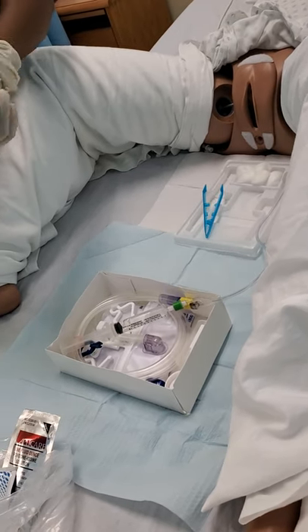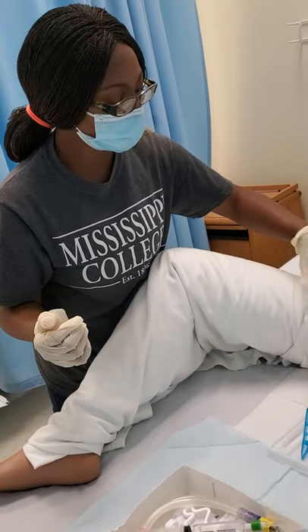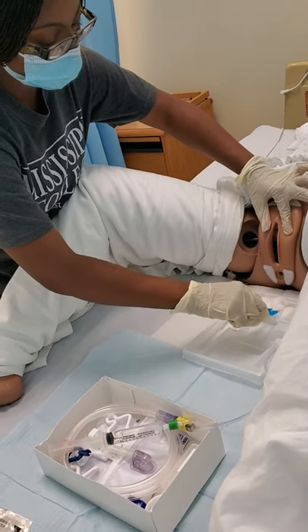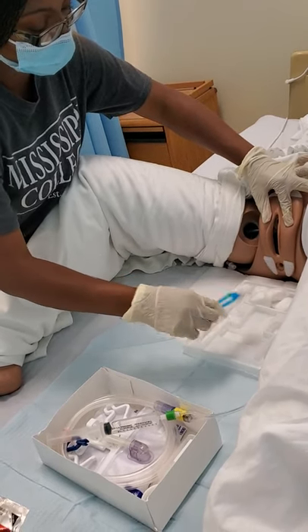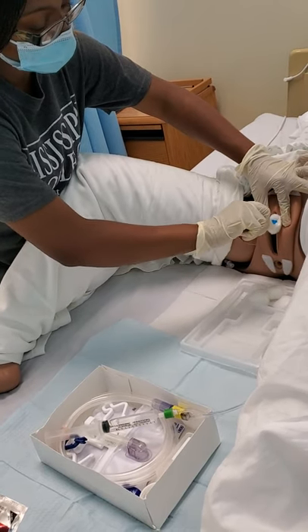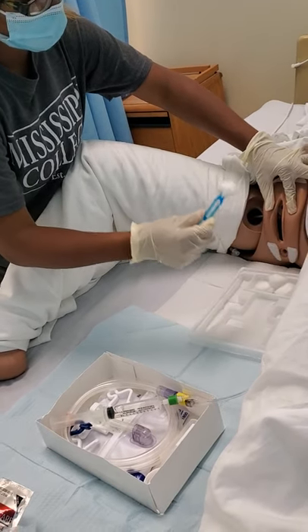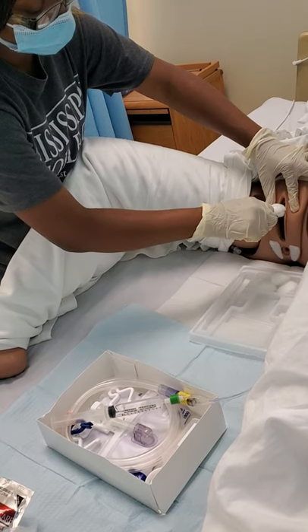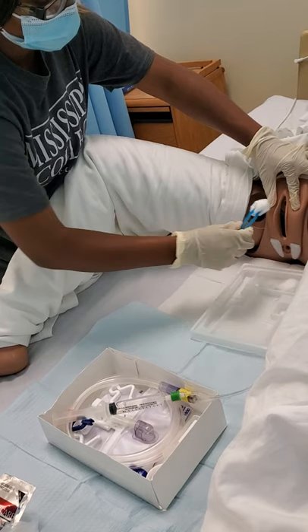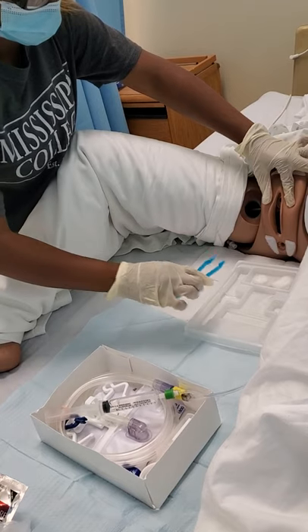Okay. Now I'm going to clean the labia. I'm going to hold the labia, and now I'm going to get a cotton ball, dip it in the iodine. I'm going to clean the side furthest from me, going up, then down. All right. Now I'm going to clean the side closest to me. Now I'm going to clean in the middle, where the meatus is.